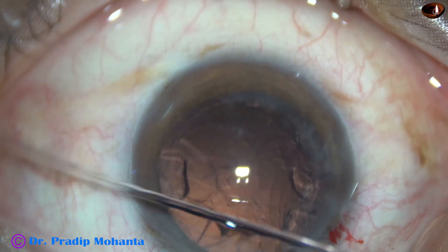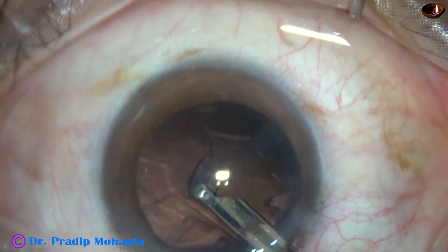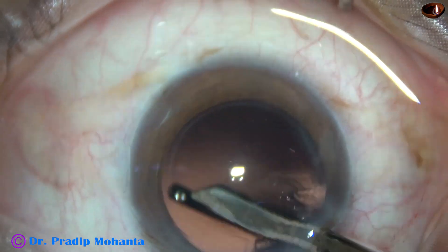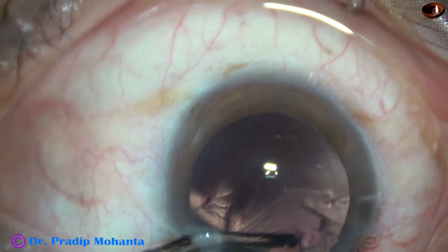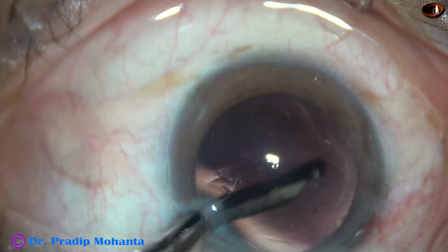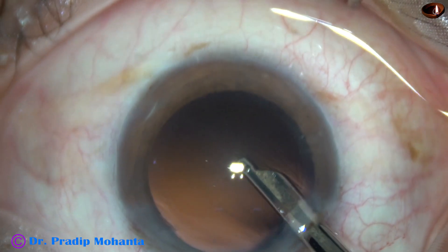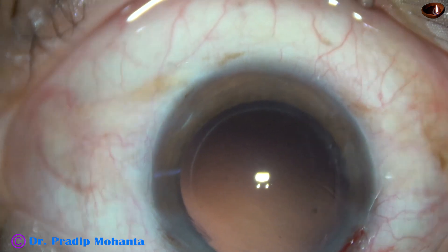Now cortical cleanup is to be done. I am going to use a 23-gauge Simcoe cannula for removal of the cortex. Most of the cortical matter has come out by this time. The sub-incisional cortex is being removed, going through the side port. In this case we have only one side port, which is about 1.8 mm in size and 3 o'clock hours away from the main incision. When the side port is 90 degrees away from the main incision and if it is a bit wider, then the astigmatism induced by the main incision may be neutralized to some extent by the side port.